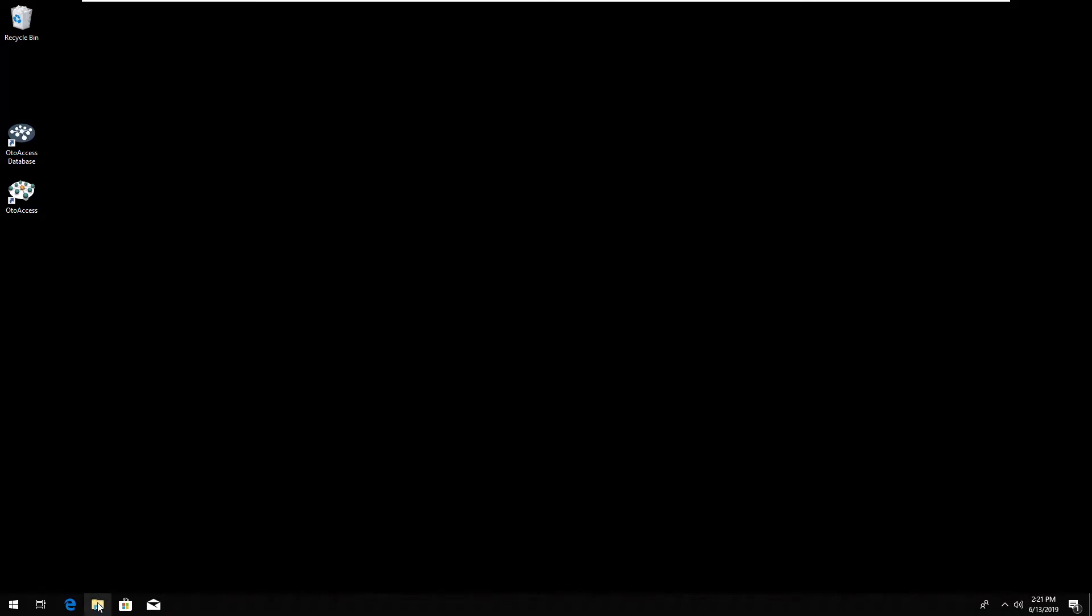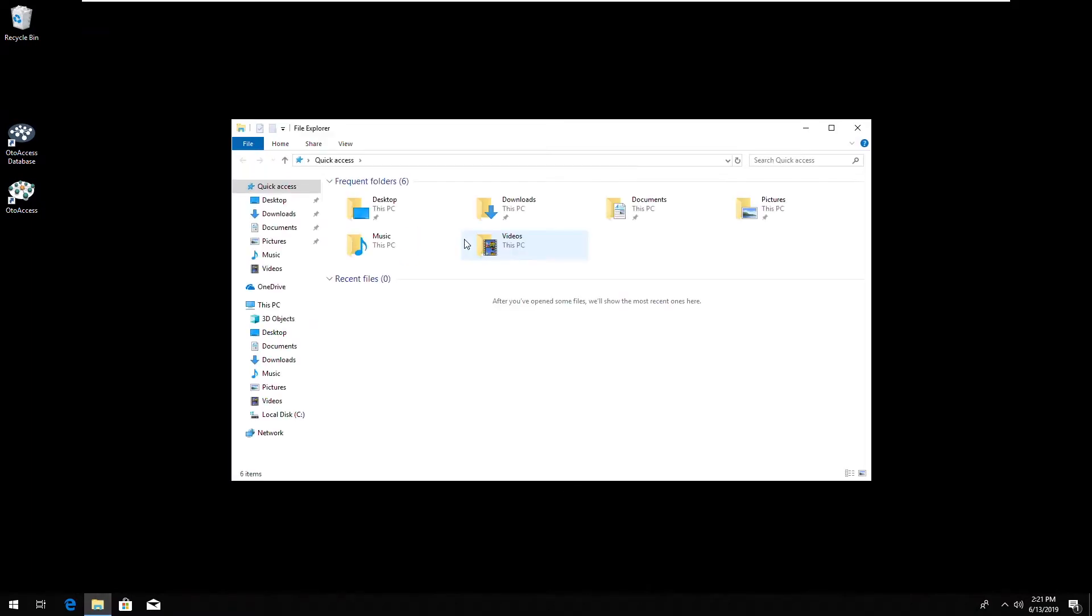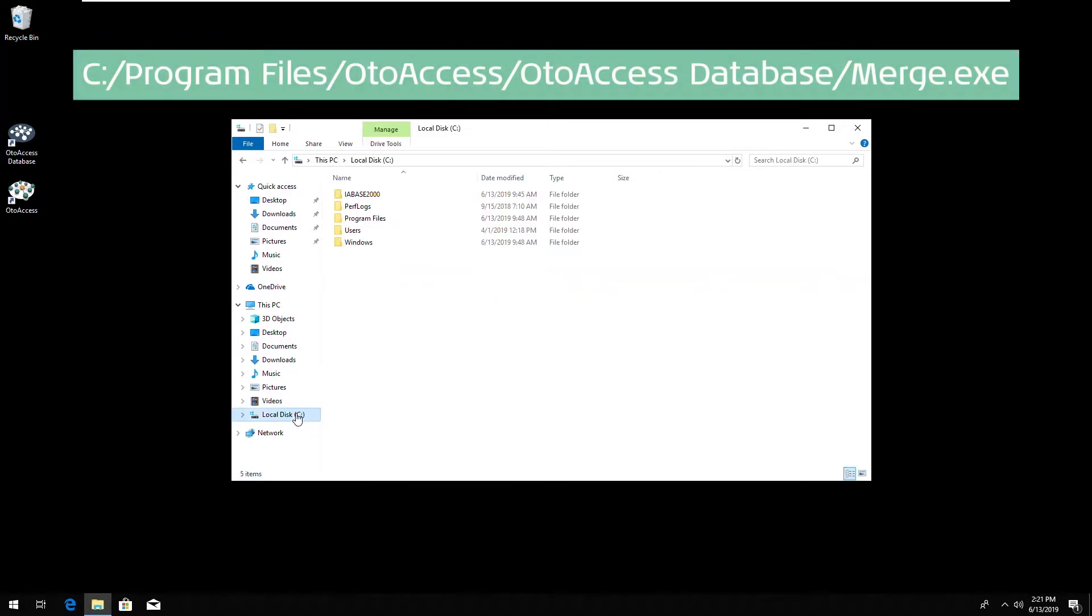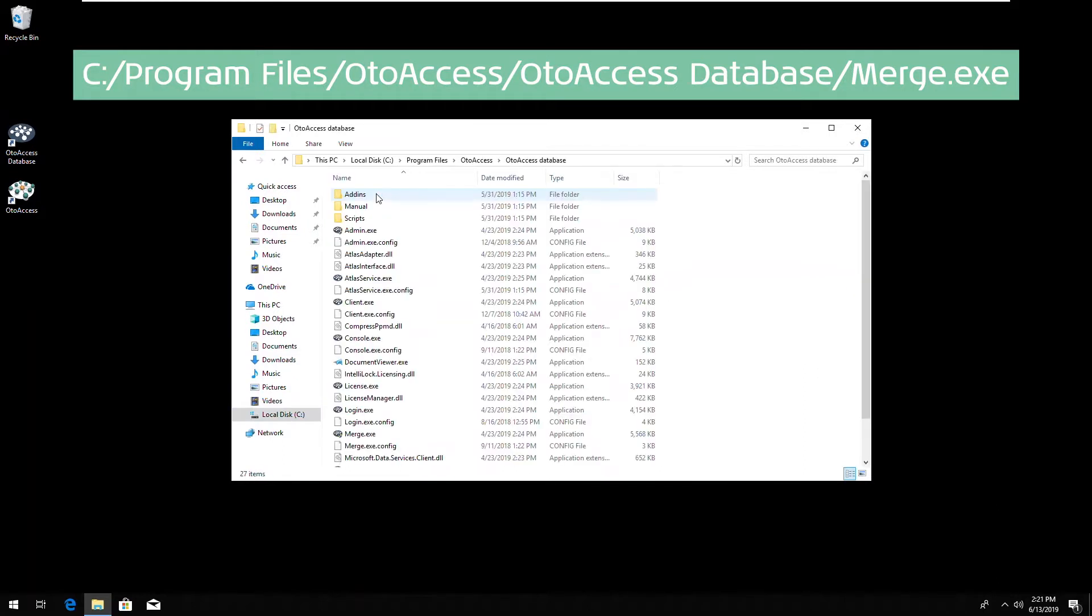To import the data, you have to browse to the AutoAccess database installation folder of the new AutoAccess database installation, and here you have to locate the merge file.